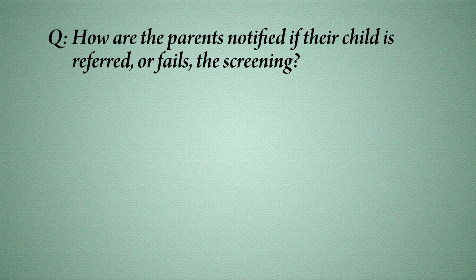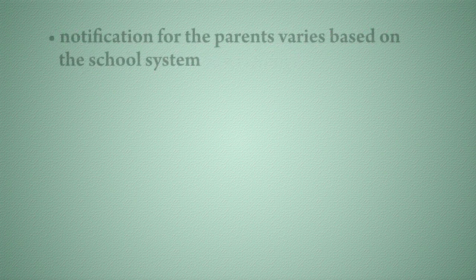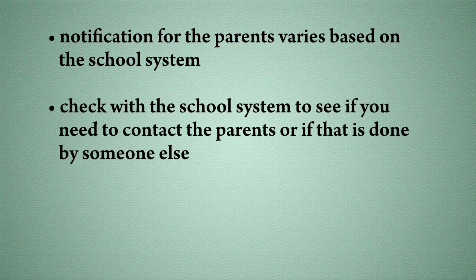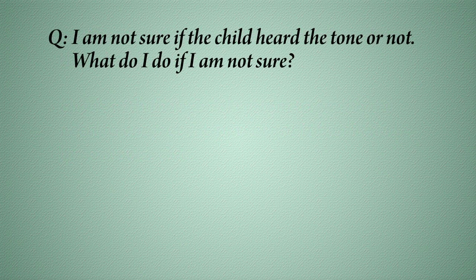How are the parents notified if their child is referred or fails the screening? Notification for the parents varies based on the procedure in effect in the specific school system. Check with your school system to see if you need to contact the parents or if that is done by someone else.